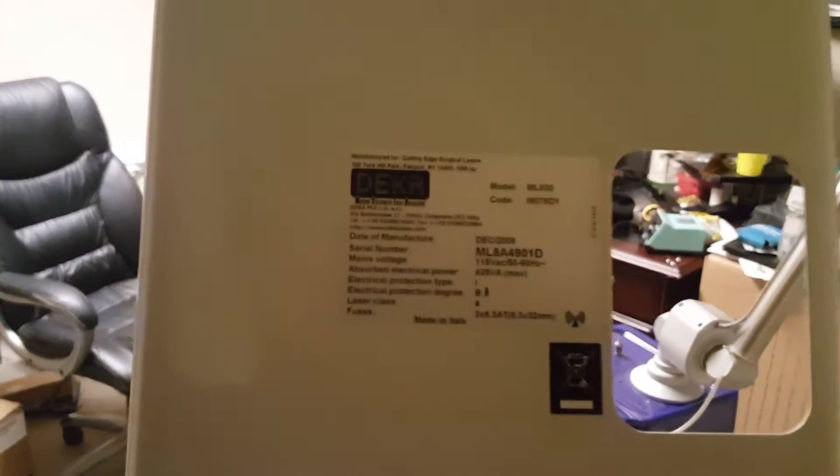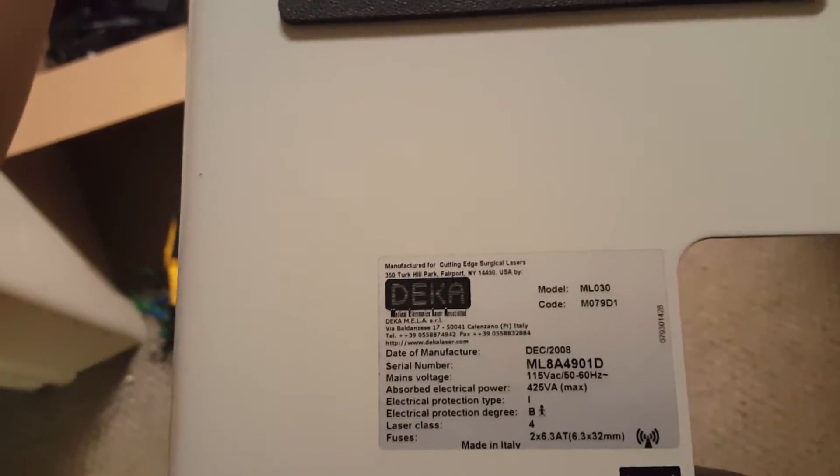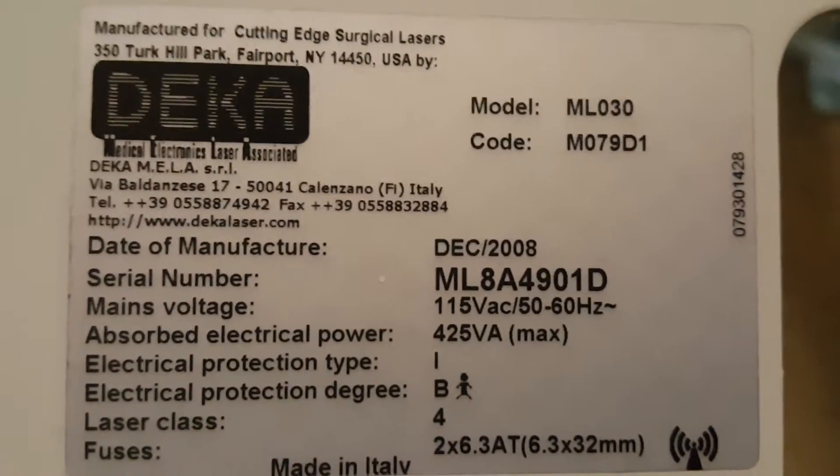I can't get a service manual for this — I've sent in an email and I'm waiting to hear back, though I doubt I'll get one. This is a manufacturer for cutting-edge surgical lasers: DEKA Medical Electronics. The website appears to be dekalaser.com. Inside the machine on the laser tube and power supply it also references ellengroup.com.